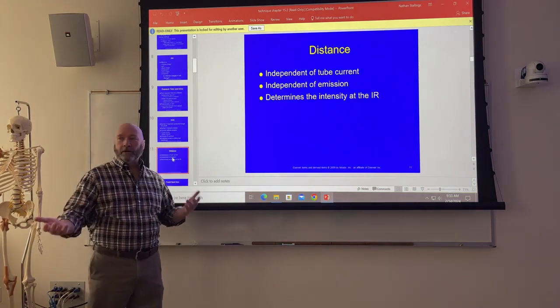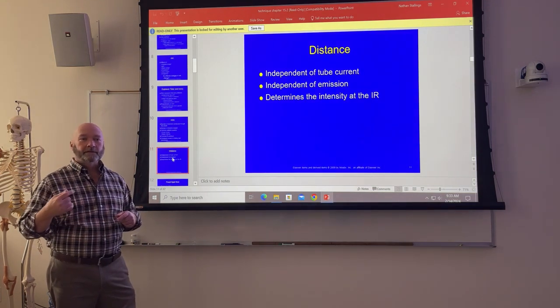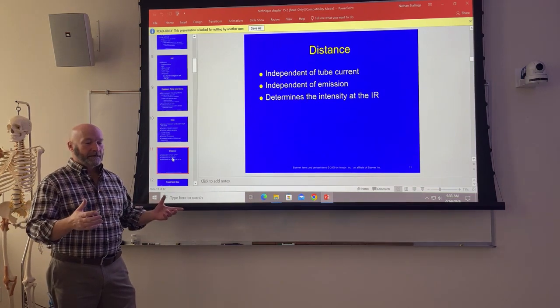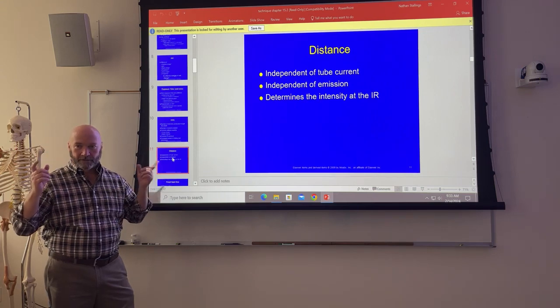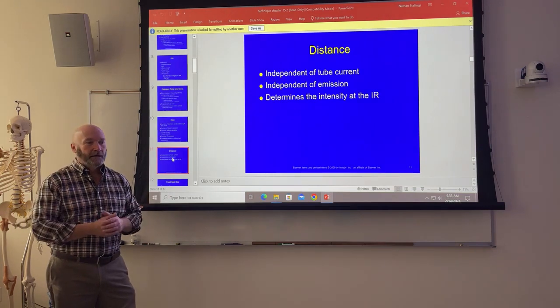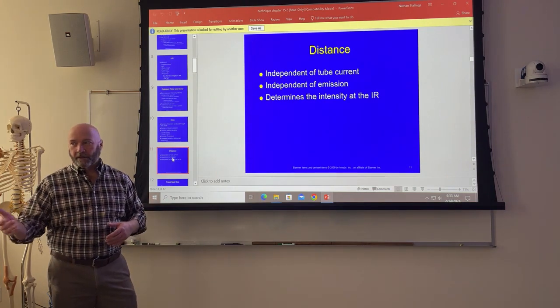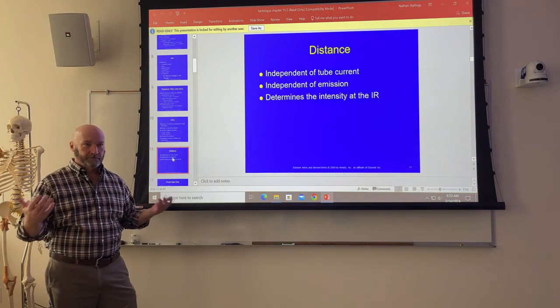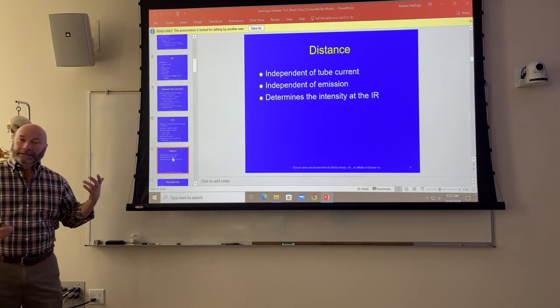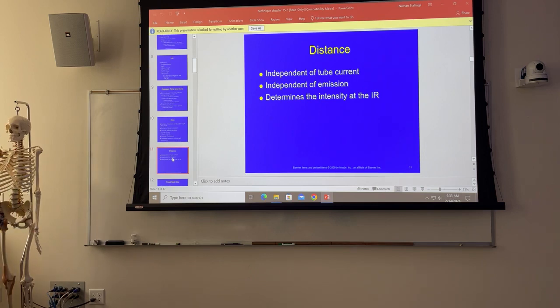Right. But we don't use 80 inches most of the time. We use 72 inches, and the cheat code for 72 inches is 3.24. And I always say that when you get to a test question, if 3.24 just doesn't lock in real well, 3.25 will get you as close as you need to be. You're never going to have a test question, even my test questions, where I'm going to give you a calculation for both of those. It's going to be, pick whatever comes closest. If you can only remember 3 1/4, that's fine. 3.25 will get you close enough, and then you just pick whatever technique is closest.